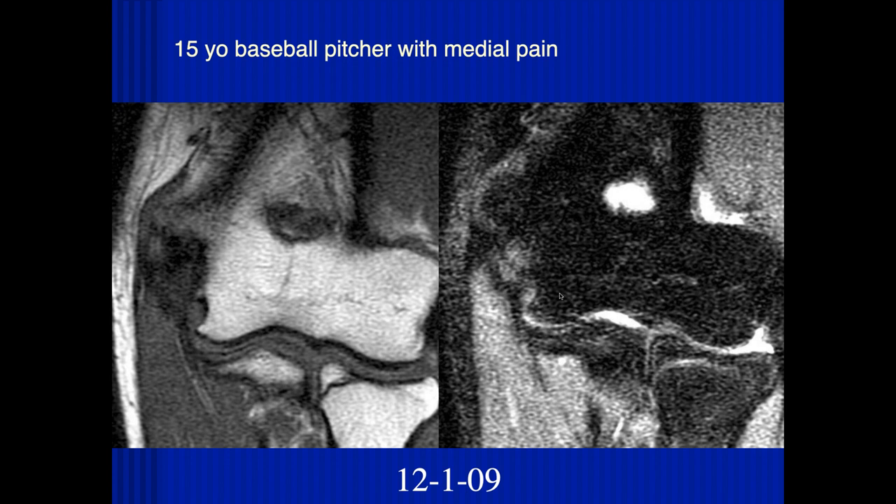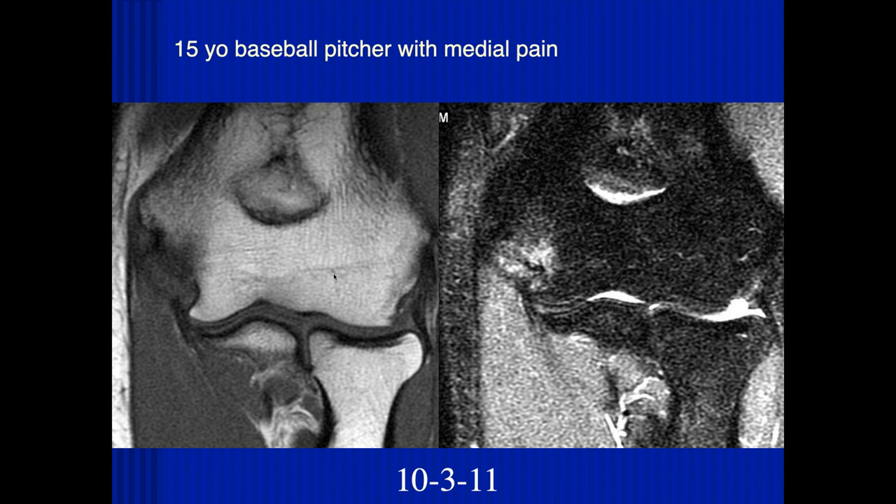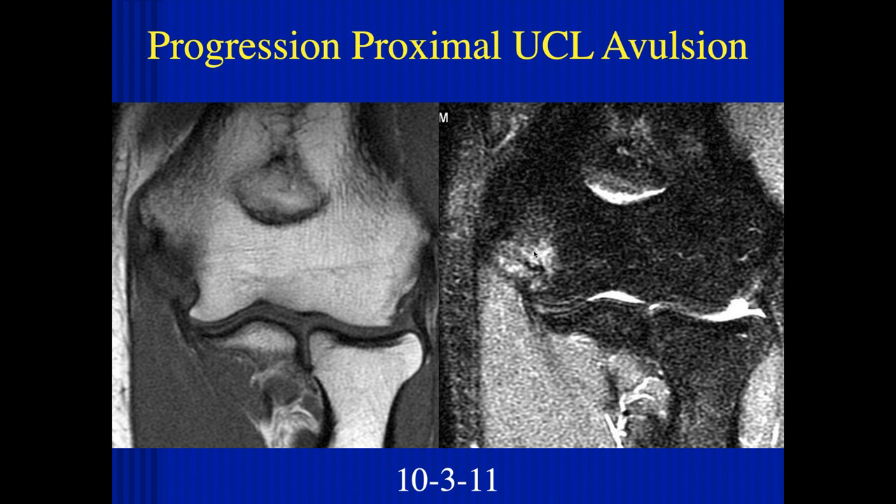It looks like there's at least a partial tear of the proximal aspect of the ulnar collateral ligament with edema. I don't see sharp fluid signal to say there's a full-thickness tear. This is on December 2009. A couple years later, there's more edema within the bone and at that interface — continuing chronic tearing and lesion. This is a progressive proximal ulnar collateral ligament avulsion. It's a good idea to get a plain film because you can often see the bony injury better on the plain film.